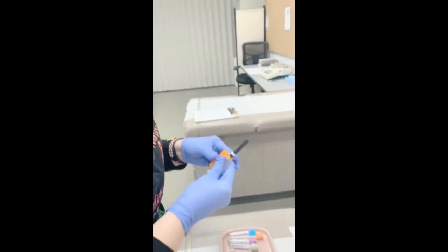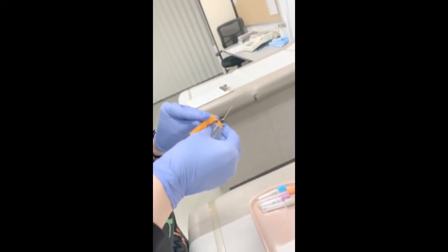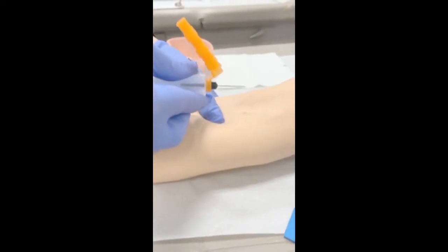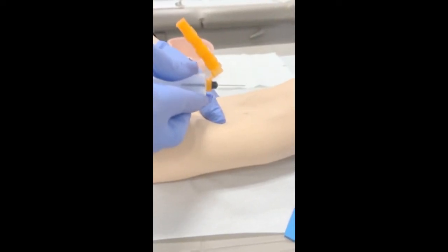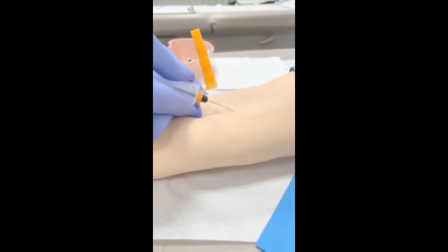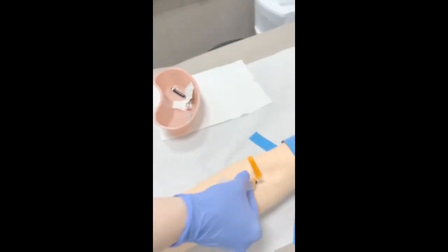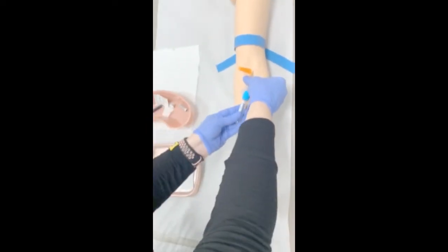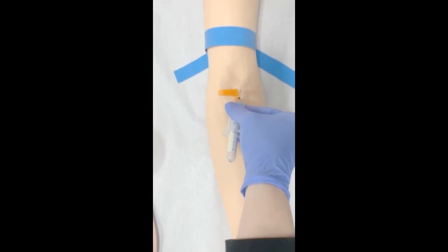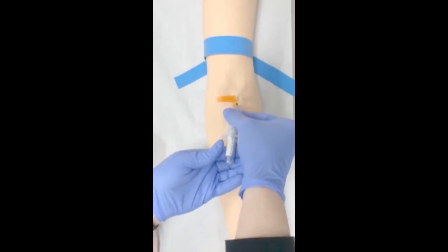She'll remove the cap from the needle and inspect it — from time to time you'll see blemishes on the needle that cause a lot of pain to the patient. Get your anchor in and hold it firmly until the needle is in the arm, usually about a quarter of an inch deep. As soon as the needle goes into the arm, you can release the anchor. Your second anchor is the fingers holding the needle. Now you're ready for your tubes — insert the tube using the flange on each side of the tube holder.